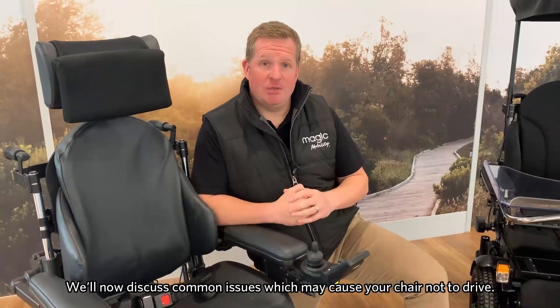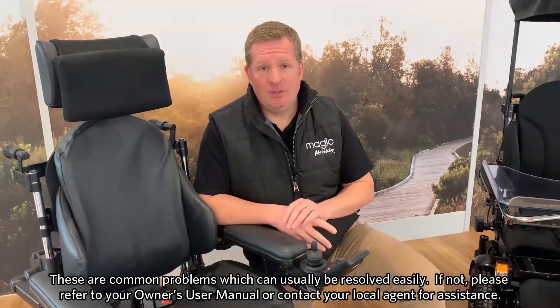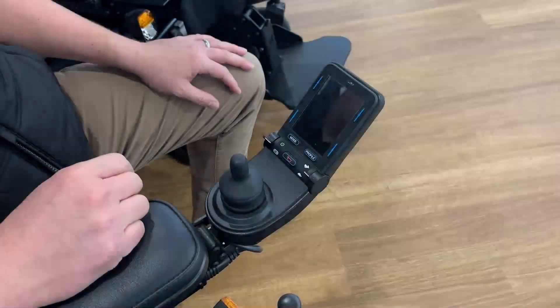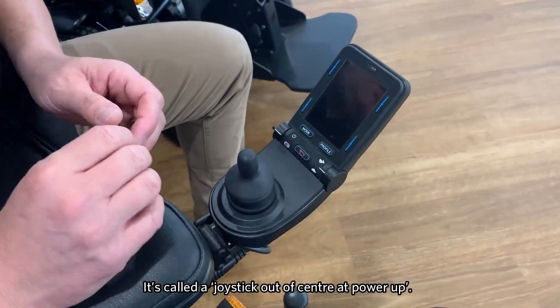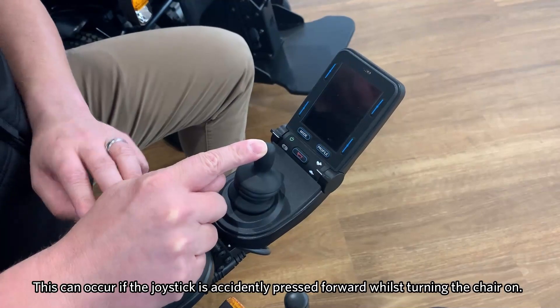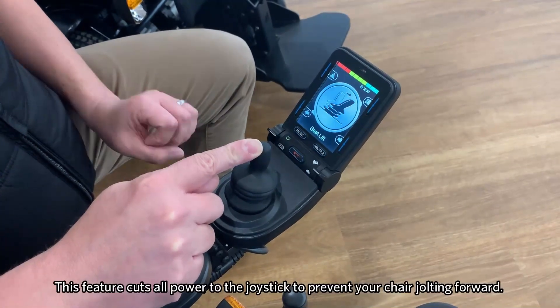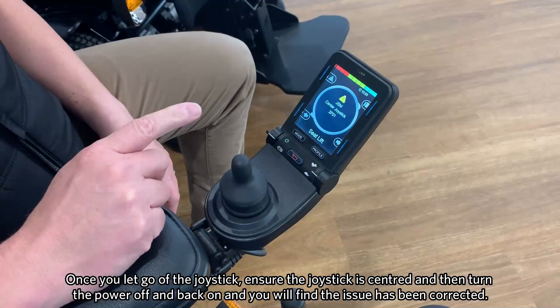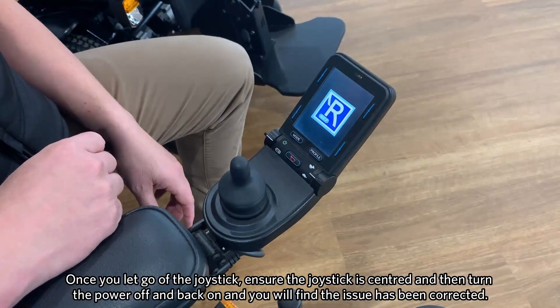Now we're going to discuss some common issues that might come up with your chair with regards to why the chair might not drive. These are common problems and for the most part can be resolved, but if they can't, we always suggest you refer to your user manual or contact your local agent. First, we'll discuss one of the main errors — actually a safety feature built into the chair — called a joystick out of centre at power-up. If I accidentally push the joystick forwards whilst turning the chair on, you'll have this screen flash up. All it means is that so the chair doesn't jolt forwards accidentally, it cuts all power to the joystick. If you let go of the joystick, ensure that it's centred, and then cycle the power on the chair, you'll find that that will correct itself.